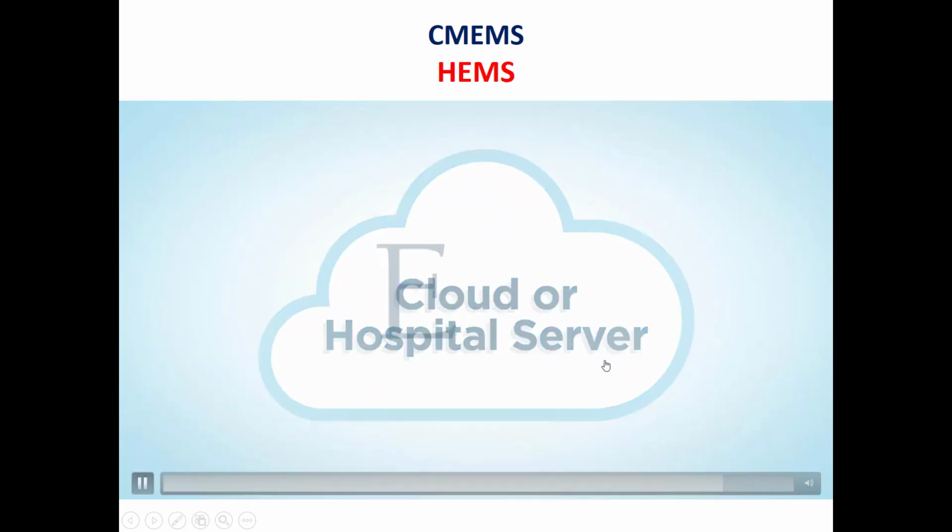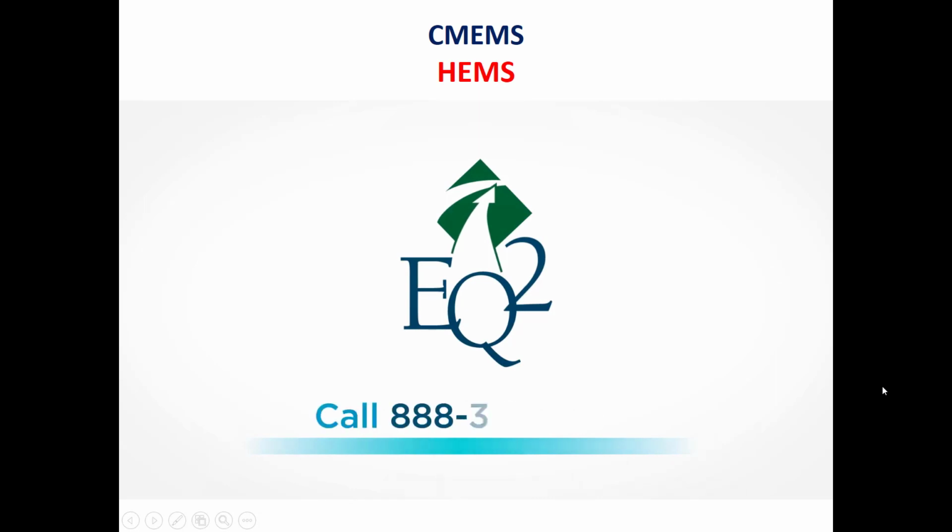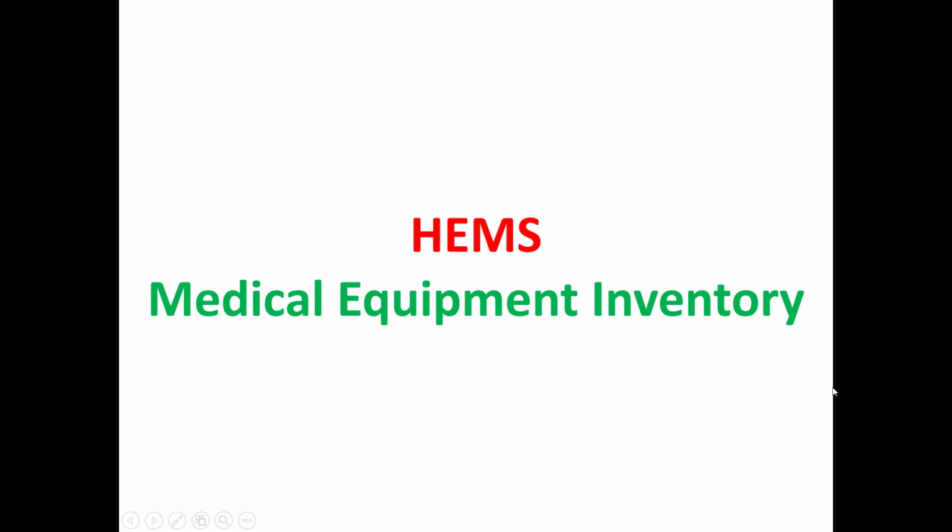So cloud or hospital server. So this is a short brief about the HEMS system. Now we'll talk about the different parts of this HEMS system.